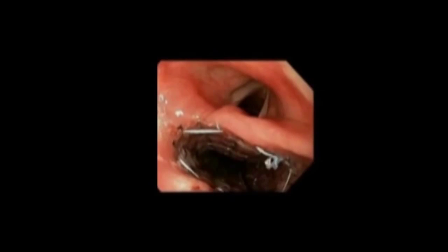The middle stent primarily bridged the mediastinal defect, and the proximal stent was deployed across the upper esophageal sphincter into the hypopharynx. The upper end of the proximal stent was precisely positioned at the interarytenoid level so as to avoid interference with the epiglottis while swallowing.